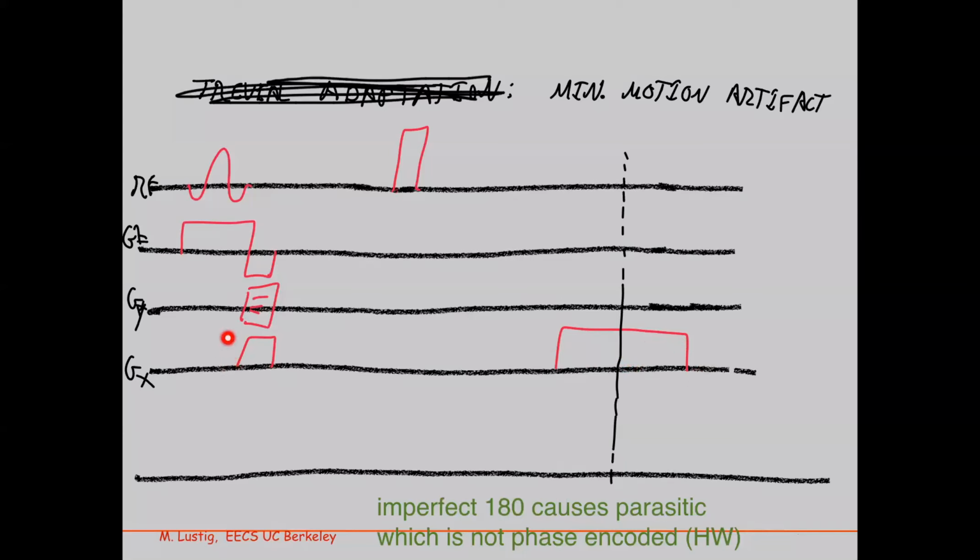And we have to flip that thing. What is that thing? Gradients. Yeah. Polarity, because of the 180. Because the 180 basically reverses whatever you do before that. Okay, so it reverses the phase, so it flips their polarity. The fact that I have a 180 over here.